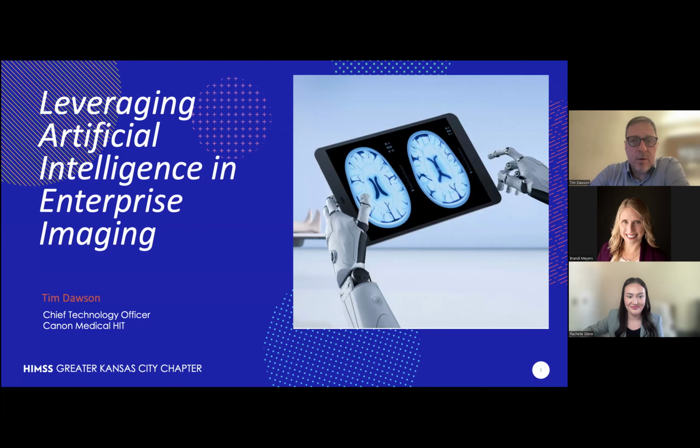There are a lot of AI algorithms that are automatically doing bone density analysis, doing new projections, even calcium scoring for cardiac cases. So these are things that take time to do that are fairly routine. And if we can automate all of that, that dramatically reduces cost and, again, physician fatigue.